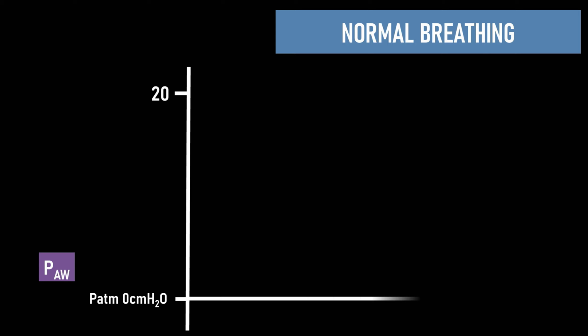This is a graphic of airway pressure and gas flow. On the bottom, we have airway pressure. This is usually abbreviated as PAW, pressure airway. I'm going to draw a line, and that is the baseline pressure. For you and me, right now, it's the prevailing atmospheric pressure. Above this line, the pressure is positive, and below this line, the pressure is negative.